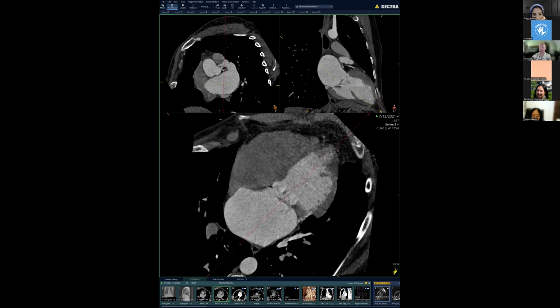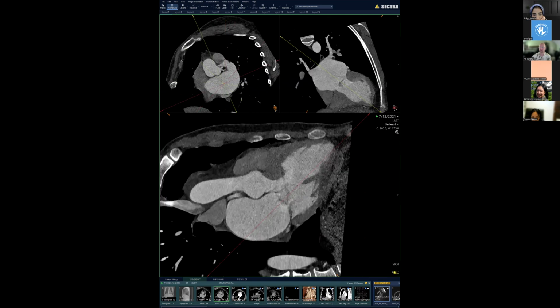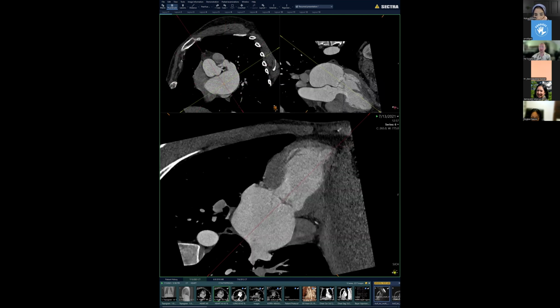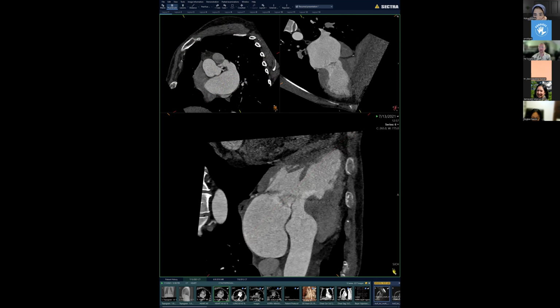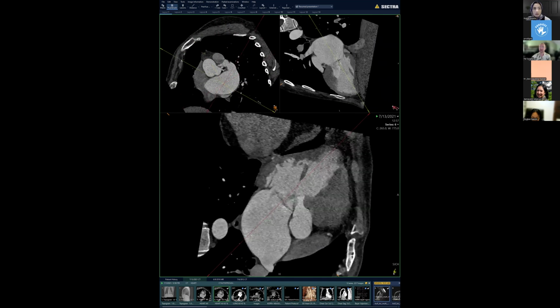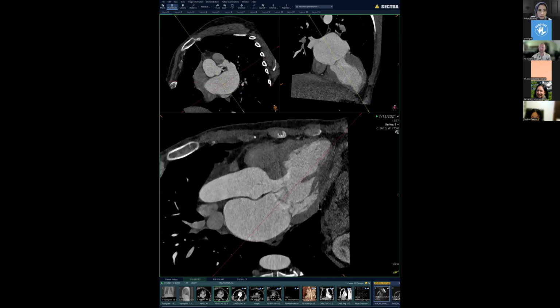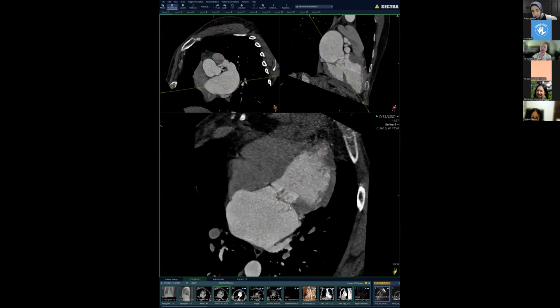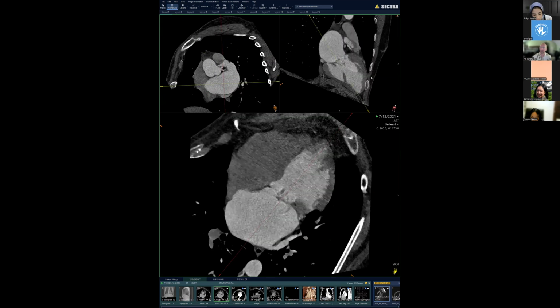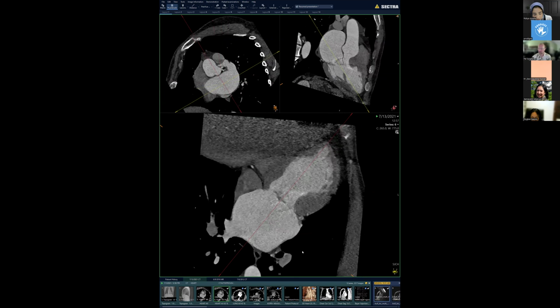of these mitral valve leaflets, but also you can see that the prolapse is actually not readily observable on all the views. This is why it's very important to examine all of the scallops of the mitral valve to identify the portion that's actually prolapsing, because it might not be visible on all of the 2, 3, 4, 5 chamber views. Maybe it's only visible on the 2 chamber or maybe on the 4 chamber. Since the P2 is the most commonly involved, it's the 4 chamber and the 3 chamber that are going to be the most likely ones that show the abnormality.